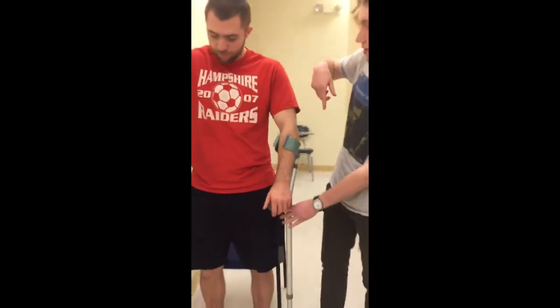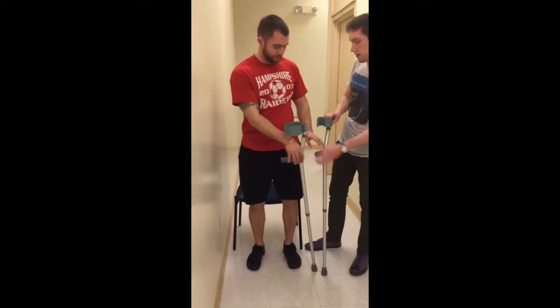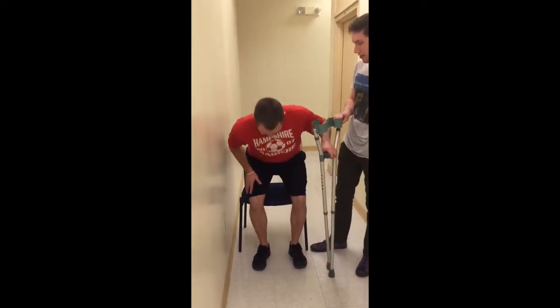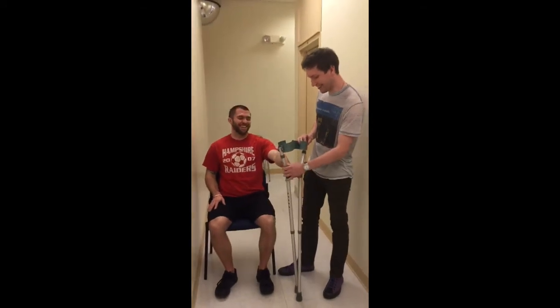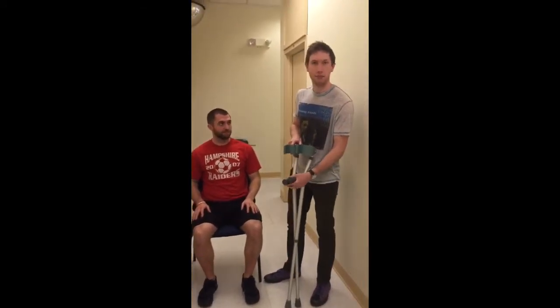Go ahead and pass the crutch to the other hand. You're doing great so far. I'm not going to help you with this. You have to learn on your own. All right? Too much feedback is a bad thing, kids.